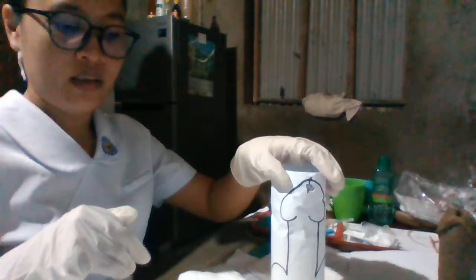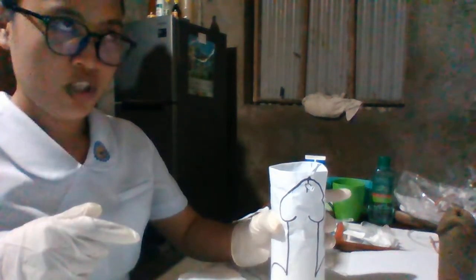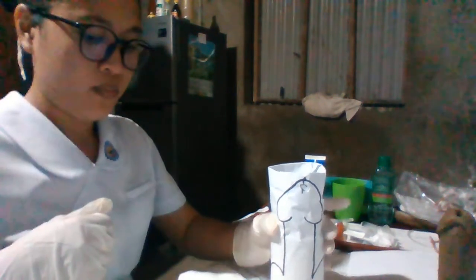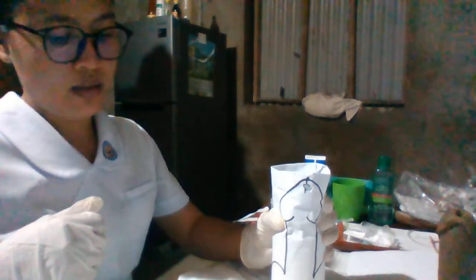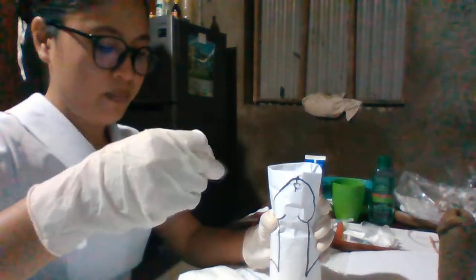With the non-dominant hand, we will grasp the penis shaft, just below the glans, and we just hold our hand in this position. With the dominant hand, pick up the cotton balls, and then we clean the urethral meatus.